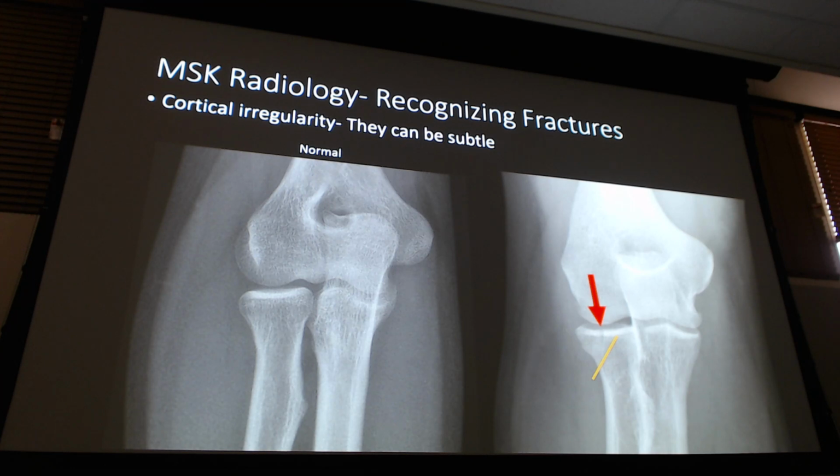And even if you, like, compare it to this bone, right? You look at all these other bones, you don't see any black lines through any of the cortices, but then there's one there. So it's another way you can use the same body part to kind of help you have these things jump out at you. Then you go through your medullary and look, that all looks pretty uniform compared to the normal. Joint spacing and joint alignment looks good. Okay, we have a radial head fracture.